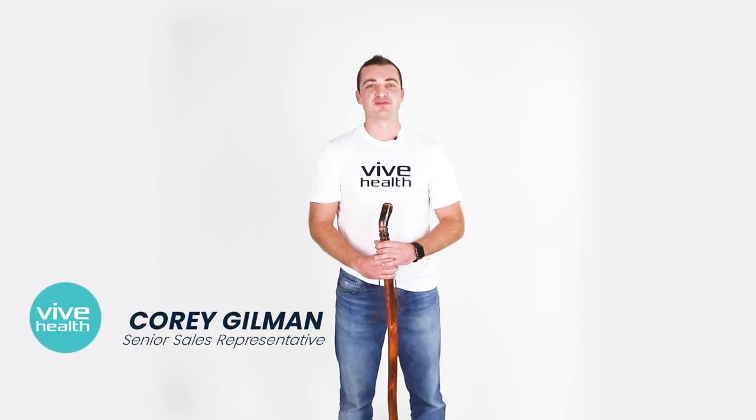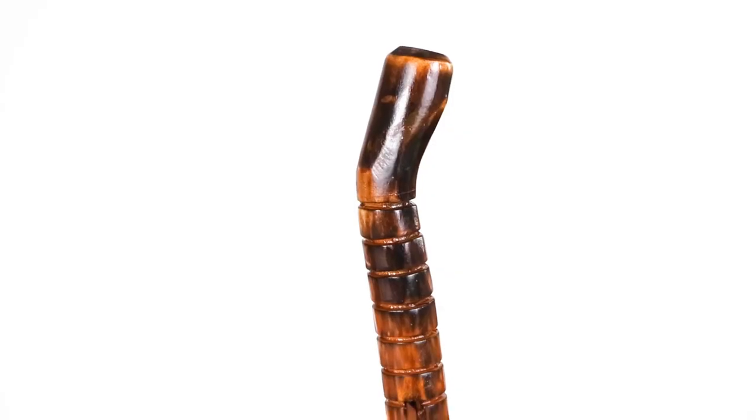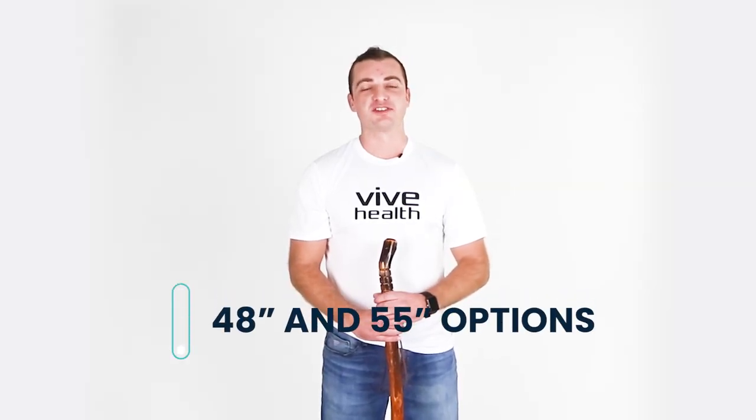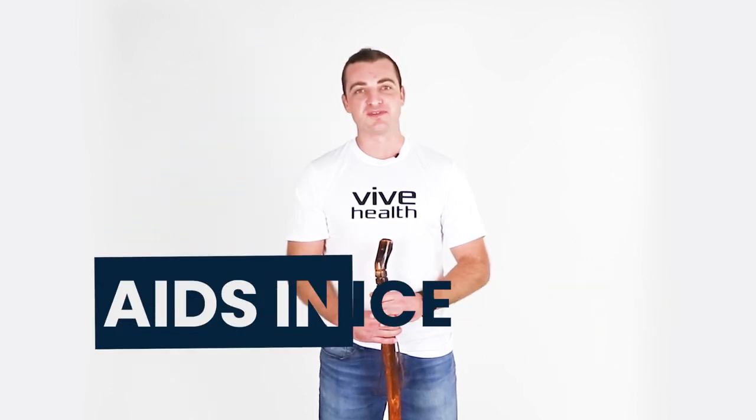Hey, my name is Cory and I'm a senior sales rep here at Vive Health. Today I'm going to be talking about our wooden walking stick. The walking stick comes in 48 inch and 55 inch options and provides stabilizing support suitable for any terrain, aiding in balance and reducing fatigue.